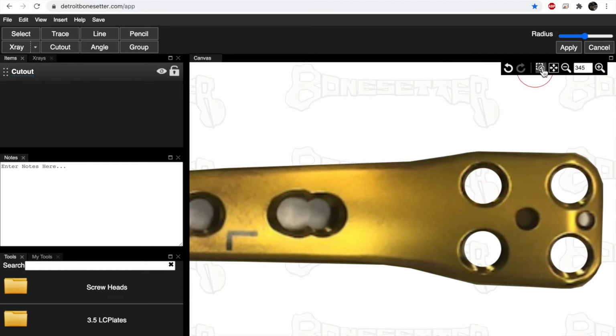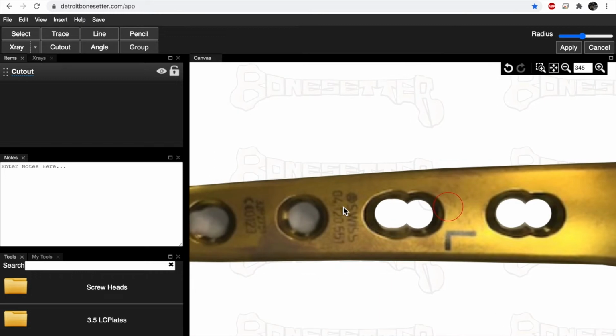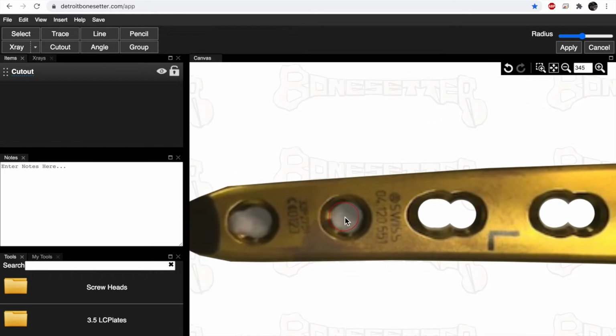Now this is a little bit big for here, so I can go a little bit smaller. There's my circle again. I'm going to take this out, and this out, and that. So there we go. Now I'm going to take this out, and again this oval, and move it over here. And every time I click on it, it's going to take out an area that's in that circle, or erase from cutout. And do the same over here. There we go. And then I go to apply.